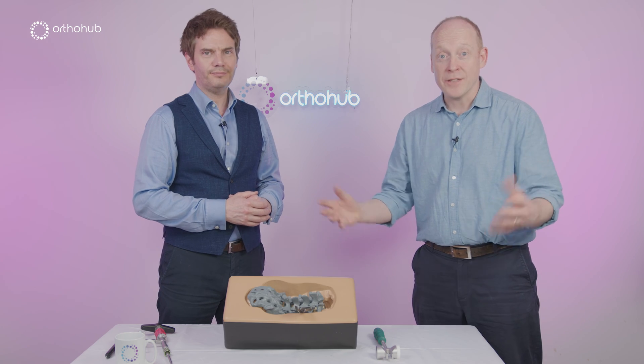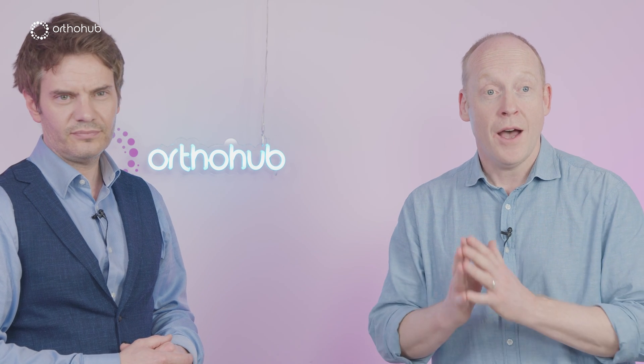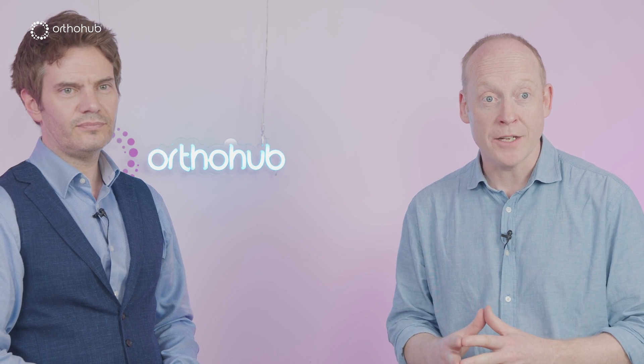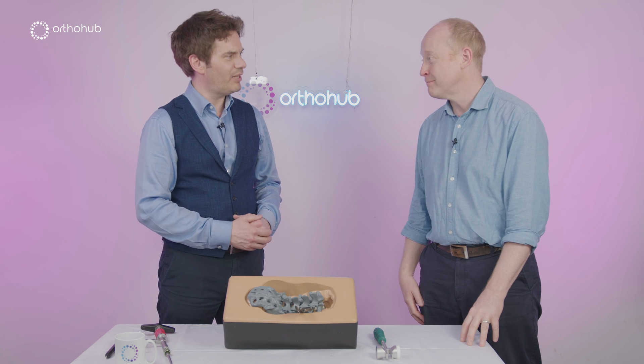And there we have it. We've looked at the unique features — the USPs — of the Viper Prime minimally invasive pedicle screw kit from J&J. Nick, thanks very much. My pleasure.